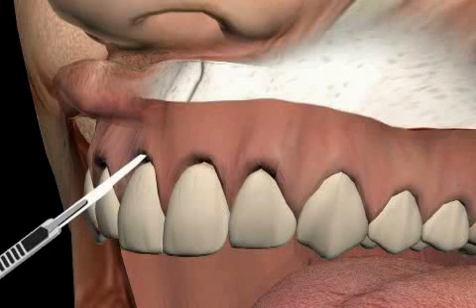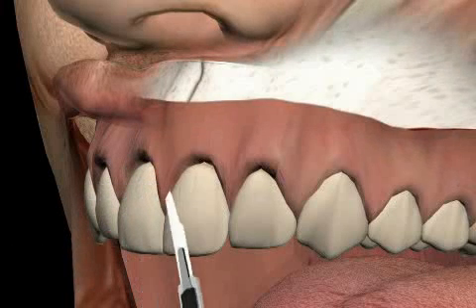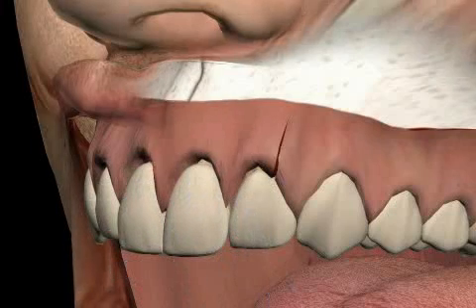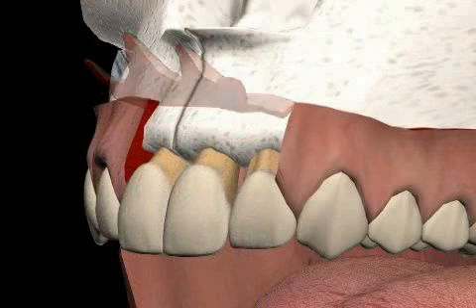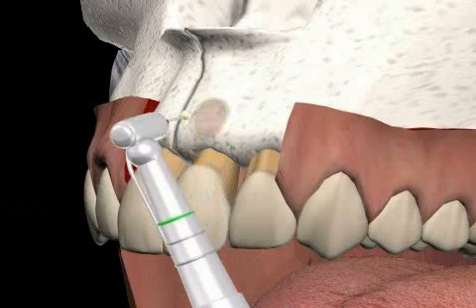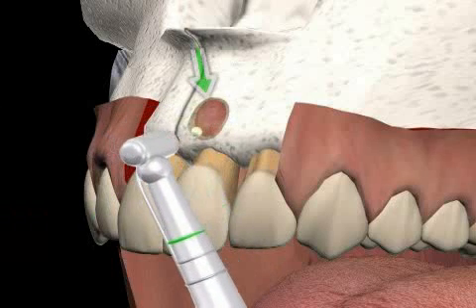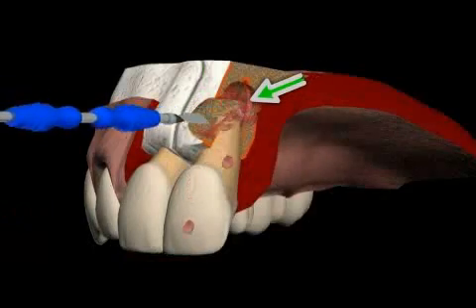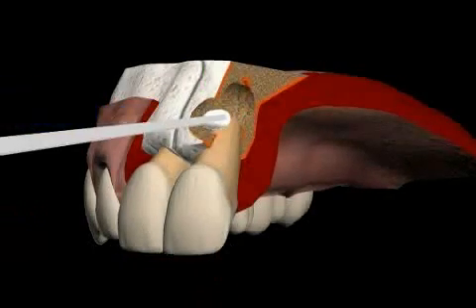Only this will seal the canal tightly. First, the gum is folded back. You can see a gum edge cut. A mucosa lobe is prepared. You see the infection on the root tip and there is still no bone formation. Granulation tissue is removed and a medication to stop bleeding is inserted.